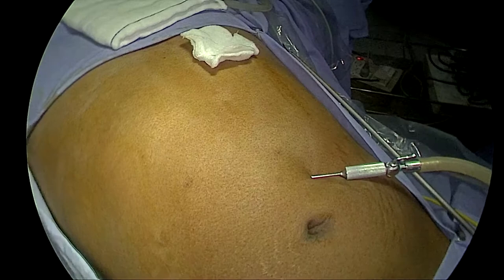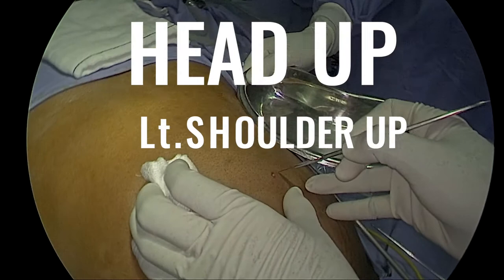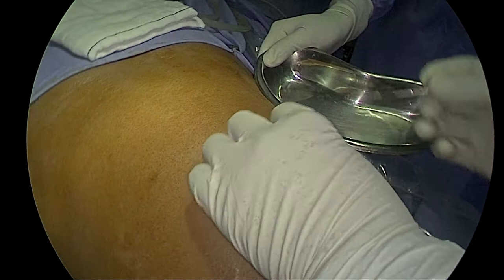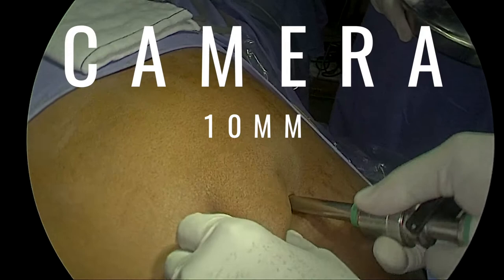The surgeon is standing in between the legs, and the position of the patient is head up and the left shoulder up. We use 5 ports, 1 10 mm for the camera. All the other 4 will be 5 mm ports. The camera port is placed above and to the left of the umbilicus. It is directed towards the midline or to the left of the midline.